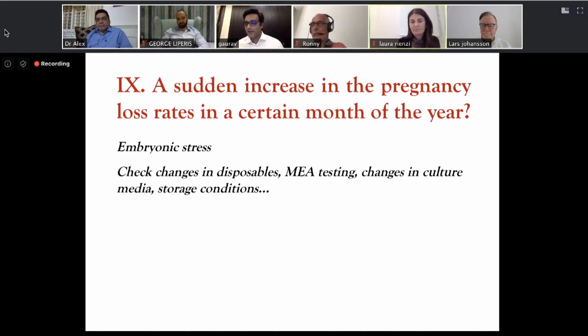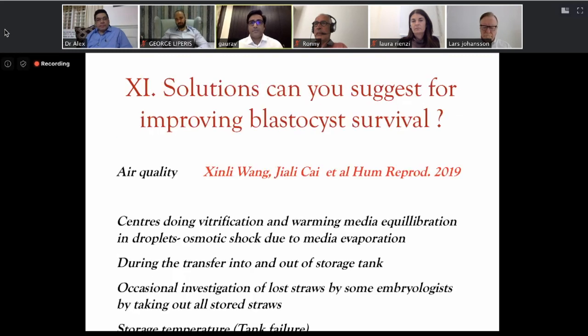All right, great. So now let's move on to the next thing, which is cryopreservation, which is now a very, very important and robust part of ART clinics today. And so now we will just talk about improving blastocyst survival. Alex, what are your tips? What are your quick fixes? What are the things that people do wrongly, and how do you fix them?